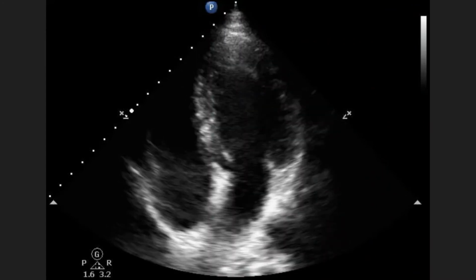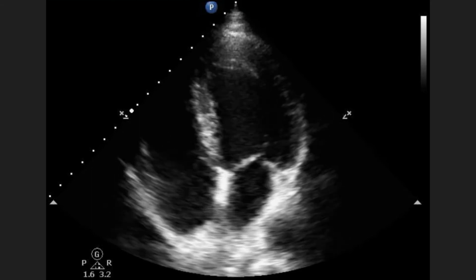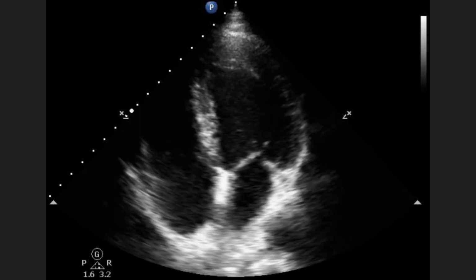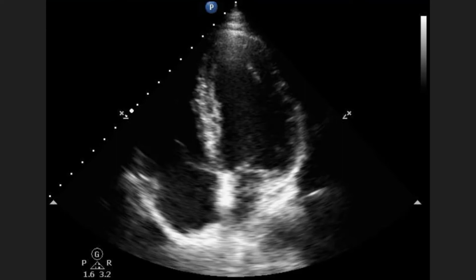Now they're opening. So this actually is what we call diastole. This is relaxation of the ventricles. Basically, it's blood going from the atria to the ventricles, and I'll explain what happens after. So during systole, when you see the valves close, that means the blood from the right side of the heart is going to the pulmonary vasculature so it can receive oxygen from the lungs. When the left ventricle squeezes, the oxygenated blood goes to the aorta to oxygenate the tissues and the brain.